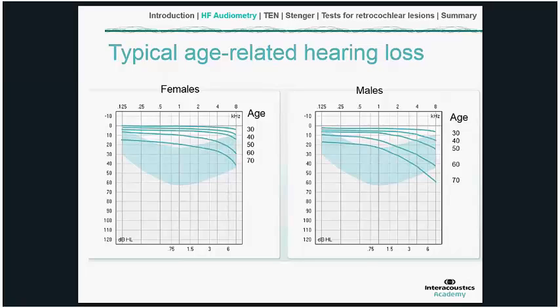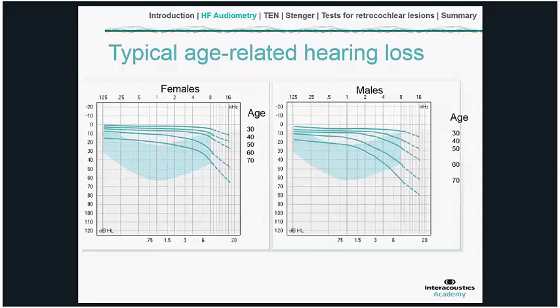But if we were to extend this audiogram into the high frequencies that we were just talking about before, above the normal audiometric range, that's what I'm showing with these dotted lines, and these are just the thresholds extrapolated into the high frequency range. And so it was hopefully clear from this that you might stand a greater opportunity to observe hearing loss from an earlier age.